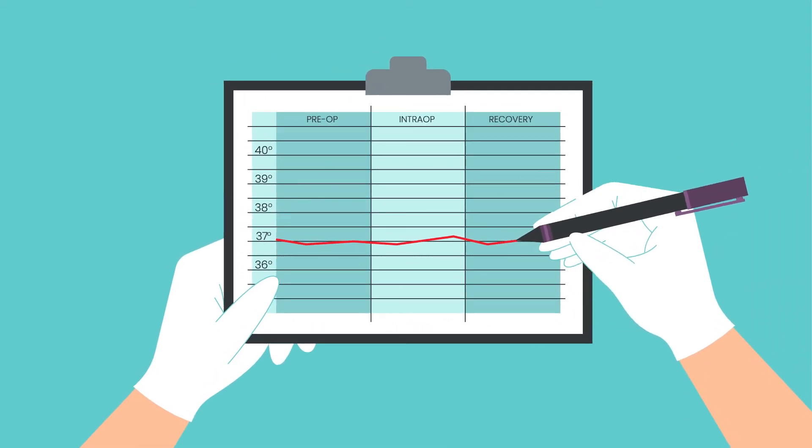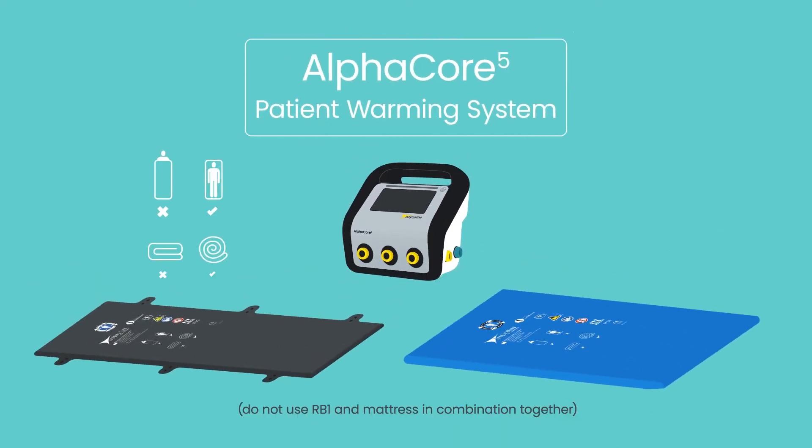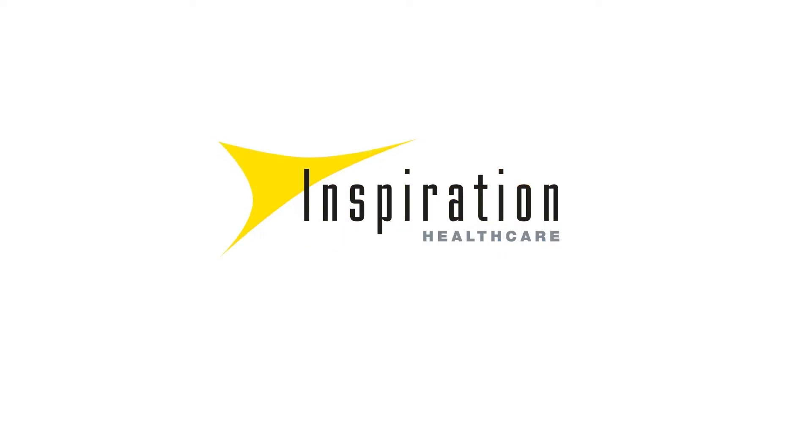From pre-op hold to recovery, AlphaCore V patient warming system offers a complete solution for the whole patient journey. AlphaCore V — every patient, every time.